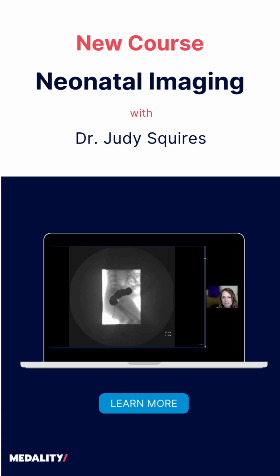And this area right here in the rectum is something that we're going to pay close attention to as we continue to fill this colon in a retrograde fashion to see if this goes away or not. One of the differential diagnoses of a distal bowel gas obstructive pattern is Hirschsprung disease, and that is where you have an aganglionic section of rectum. So it is unable to relax, and so you'll have focal narrowing of bowel at that level.